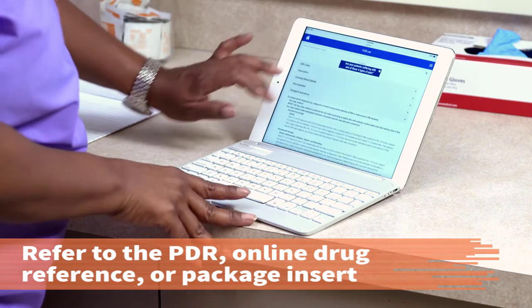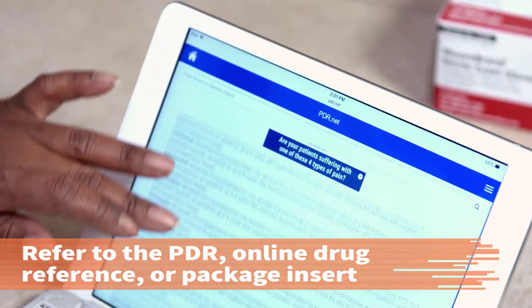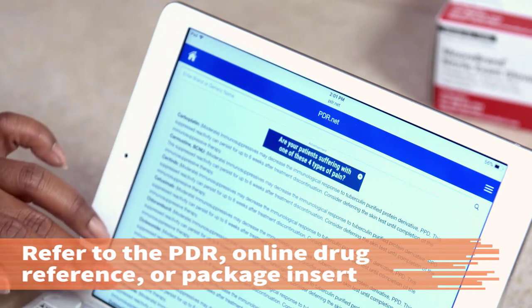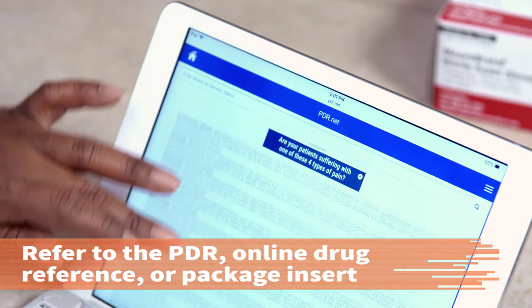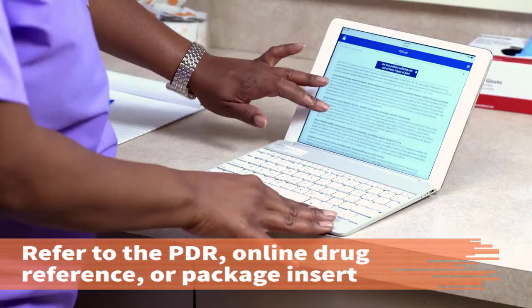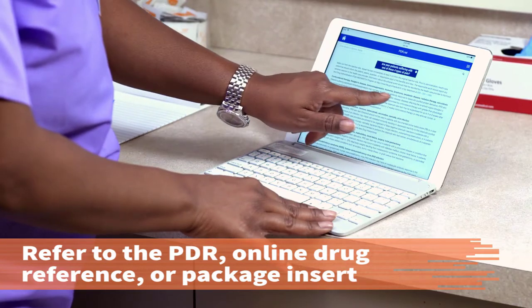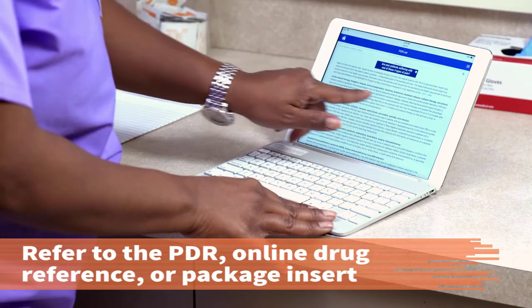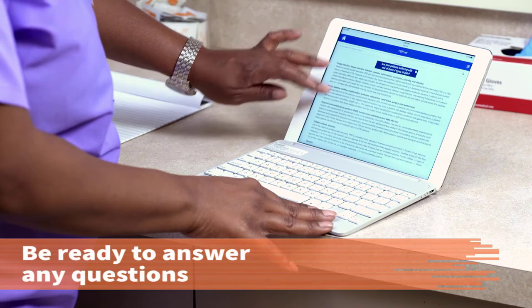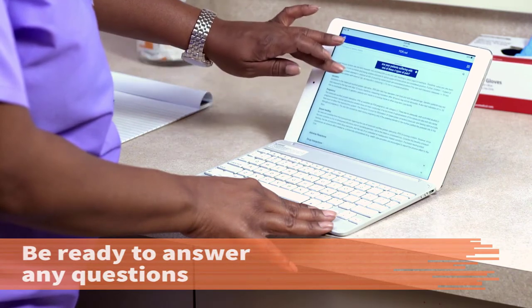refer to the PDR, online drug reference, or package insert to determine the purpose of the drug, common side effects, typical dosage, and any pertinent precautions or contraindications. Be prepared to answer any questions the patient may have about the medication.